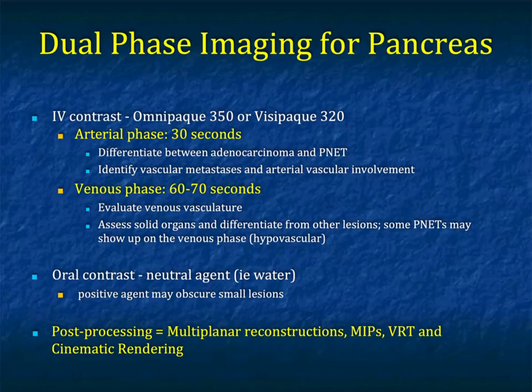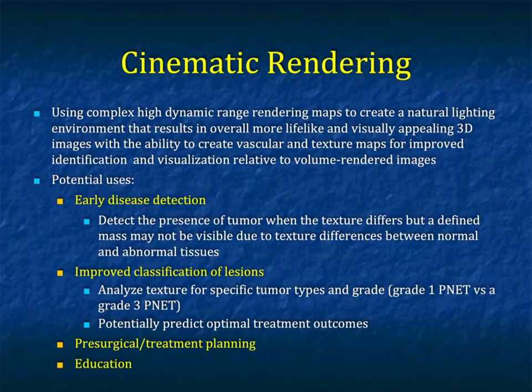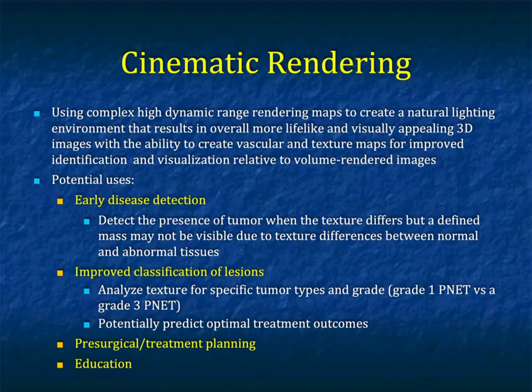For MIP imaging, anything that's very vascular benefits greatly. In terms of cinematic rendering, it creates a very natural model. When you compare the vascularity of the pancreas and these tumors, it really makes them show very nicely. I have found at times it's easy to pick up neuroendocrine tumors with cinematic rendering that you might miss with routine imaging if you're not very careful.